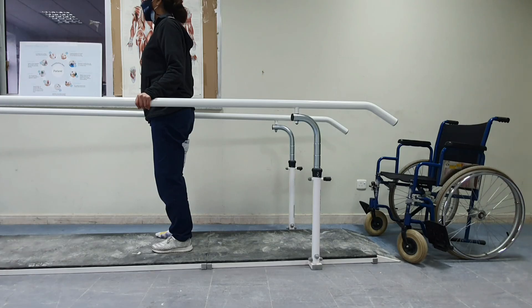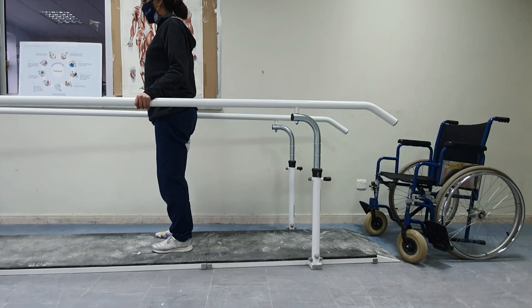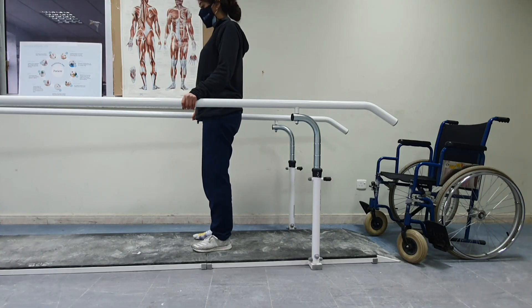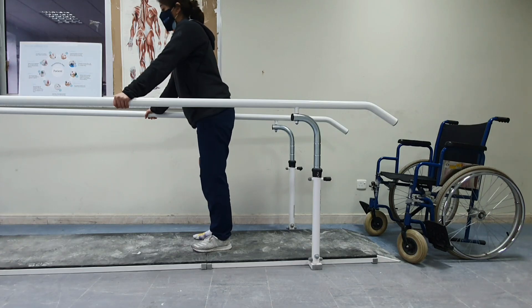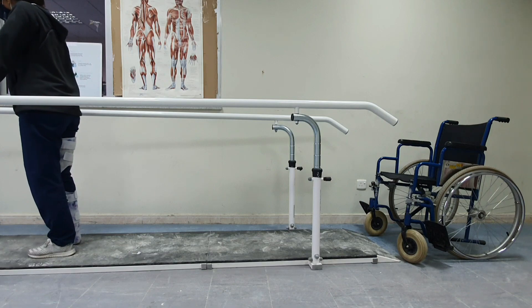Once the patient masters four-point gait, we move to the swing-through pattern. This relies on the push-up just learned: the patient moves both arms forward, performs a push-up, and using the head-hip relationship advances their legs forward by moving the head back. This is the swing-through gait.